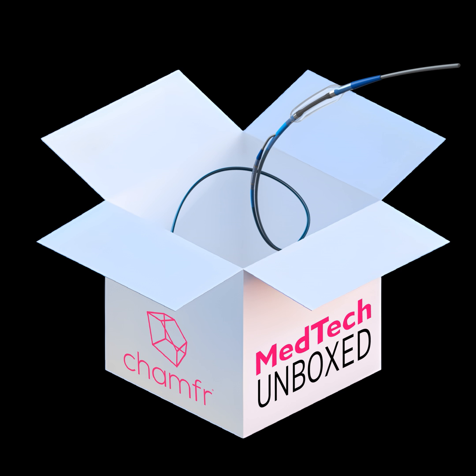I don't think anybody has that capability in catheter simulation software. The steerability. Am I correct there? Not without doing a full FEA, which is difficult and costly.